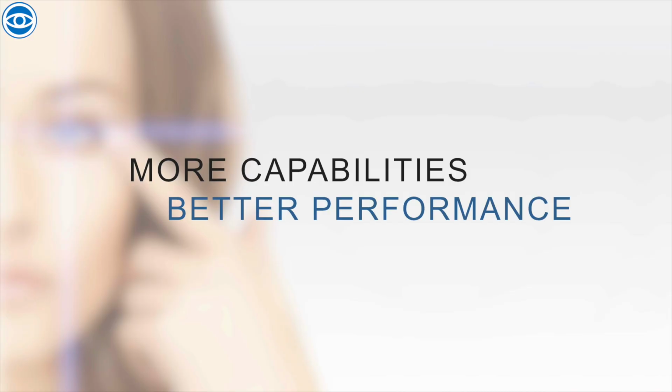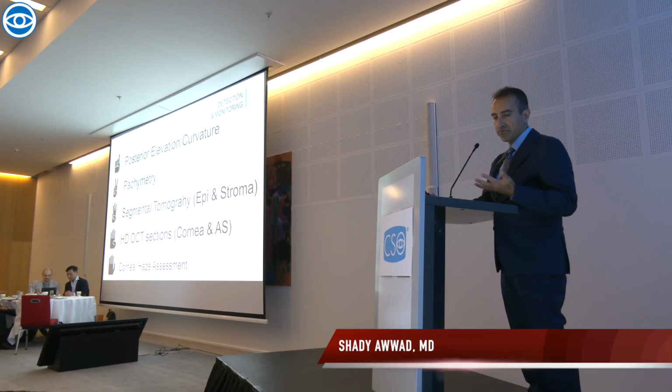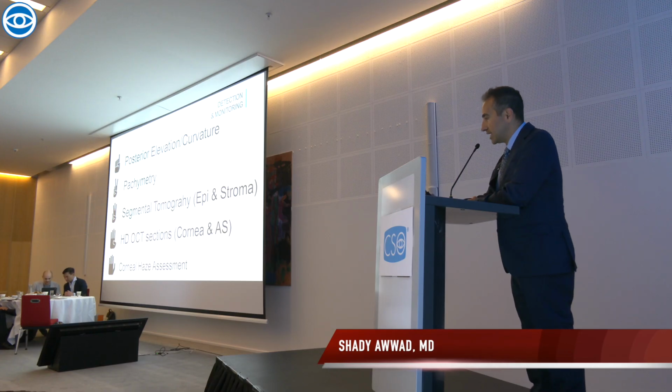So typically, as you saw, OCT offers better capabilities than Scheimpflug: posterior curvature and elevation, pachymetry, segmental tomography, HD OCT sections, and corneal haze assessment.